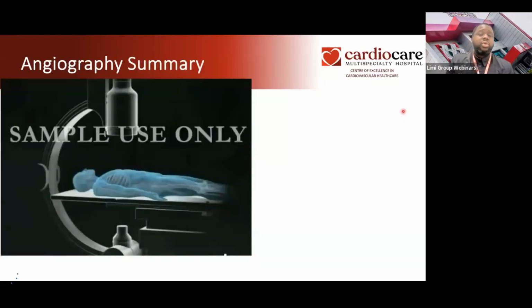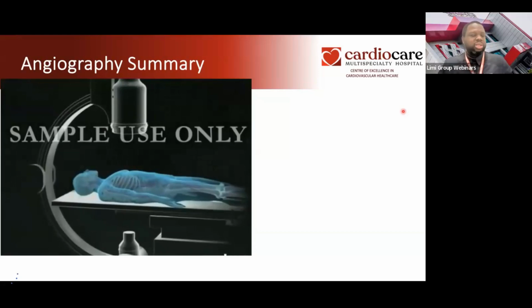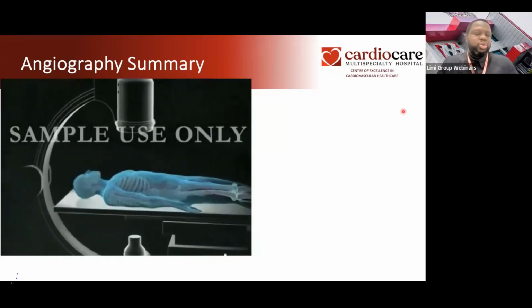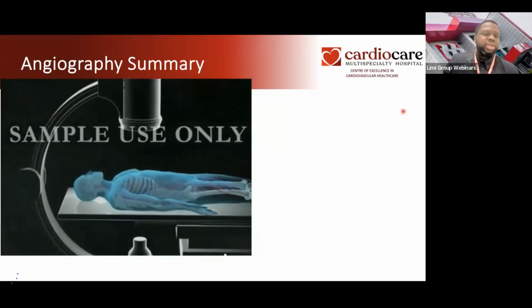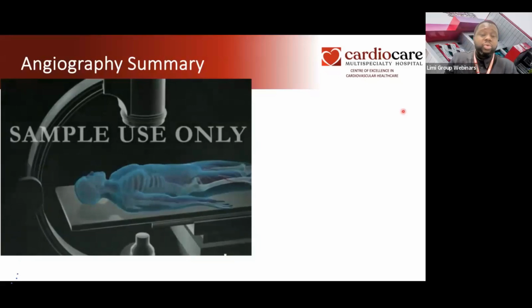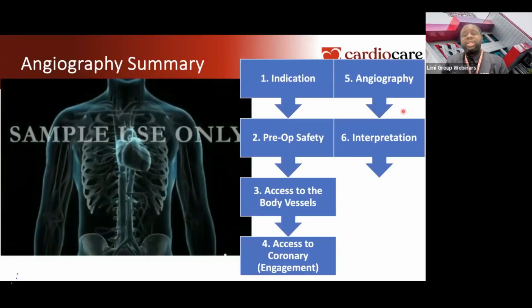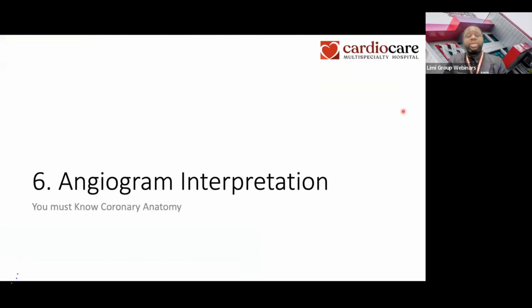So this is one of the complications that could happen, even though coronary angio is largely safe. I told you 99.8% safety, less than 0.2 to 0.5% risks, or sometimes up to 1%, especially patients having an MI, 1 to 2% in an MI. So we've gone through assessment. Now it's time to interpret this angio.